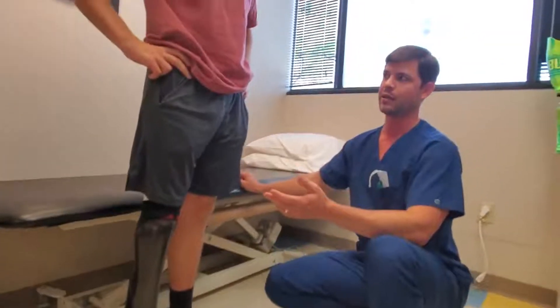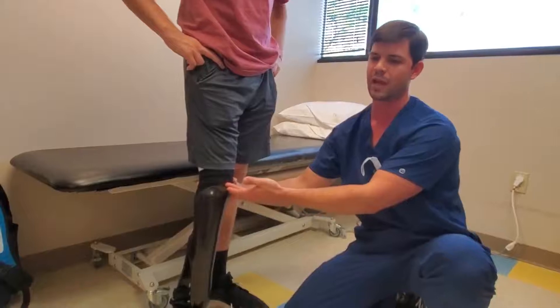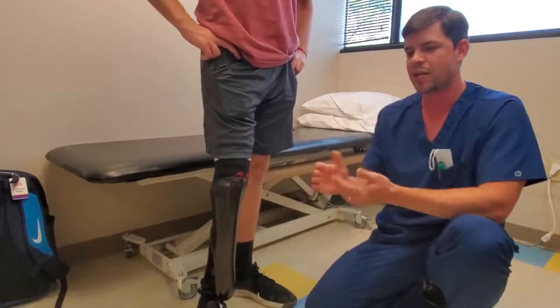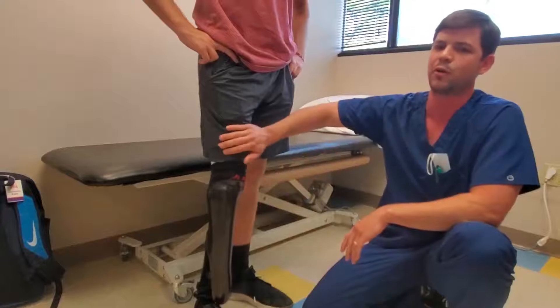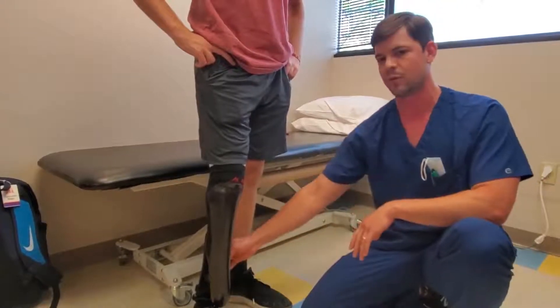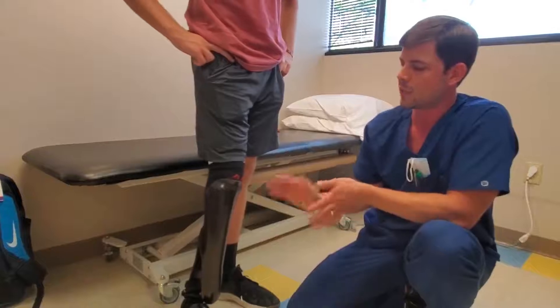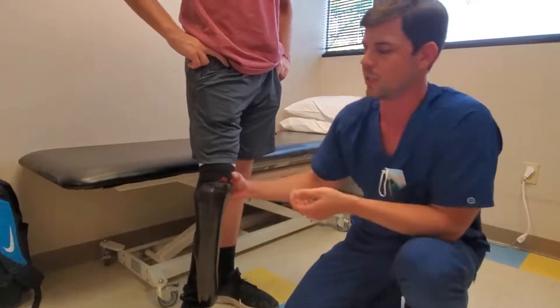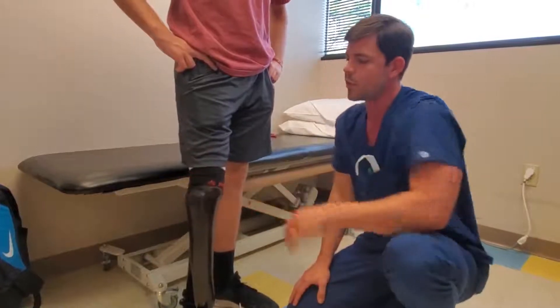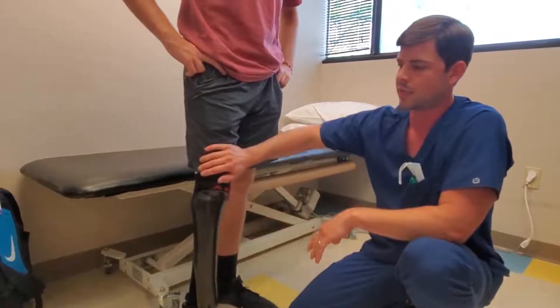He's had this leg for about two or three days, and we've been playing with the alignment. Because the trim lines are lower, he's been noticing some shifting into valgus while standing, or going into varus while walking. We've adjusted the adduction angle a few times to accommodate his feedback. We've noted that if he uses his muscles to control it, he can eliminate a lot of those varus or valgus moments, both statically and dynamically.